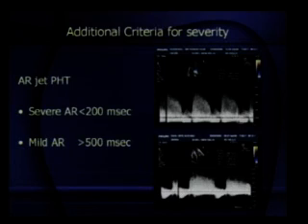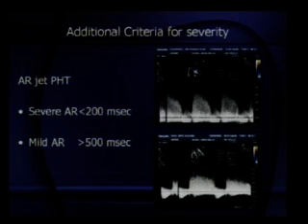The understanding here is very clear that there shouldn't be any mitral valve disease associated, right? And there should be no severe aortic stenosis. So it should be free aortic regurgitation, and then pressure half time, if it is less than 200, it shows it is severe AR. So there are many patients who have isolated aortic valve disease in which pressure half time will help you. But the concept of pressure half time, as you know, was started with mitral valve area.